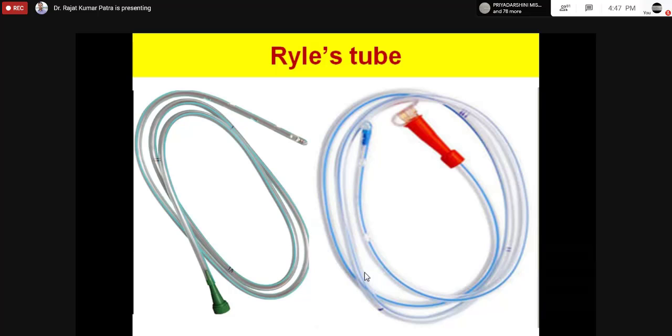Pre-operative, okay, very good. What else? What surgical condition do you use this Ryle's tube in? Post-gastrectomy. Obstruction. Very good, okay. In case of any obstruction, perforation cases, okay. Any upper abdominal surgery, sir. Any upper bowel, meaning small intestine surgery, stomach or small intestine, we normally use this, okay, in pre-op also, in post-op also, okay, right.